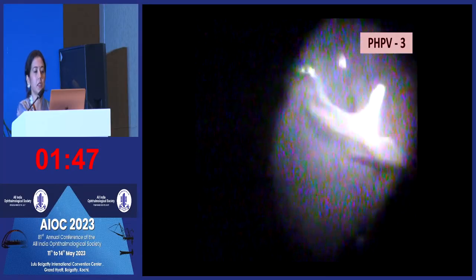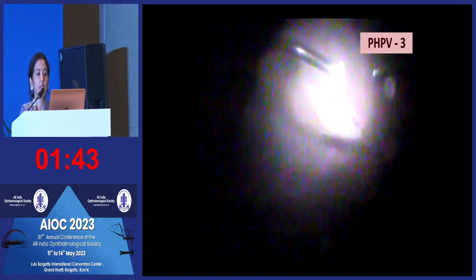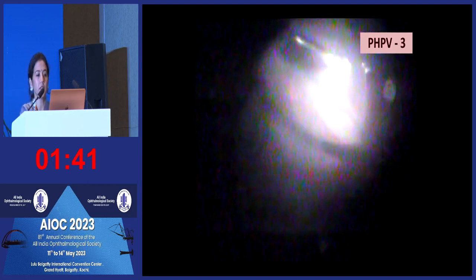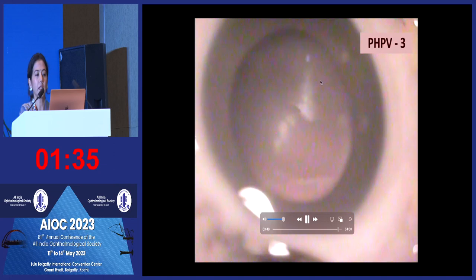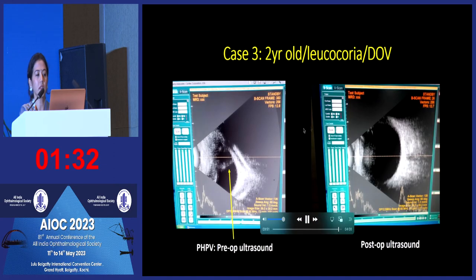Because this patient had a macular TRD, we had to do a more extensive vitrectomy and release all the traction from the retina. And once you release the traction, then the retina falls back into place. So there is some tag here, fibrous tissue, but it was not in the central pupillary area. So it was left alone.